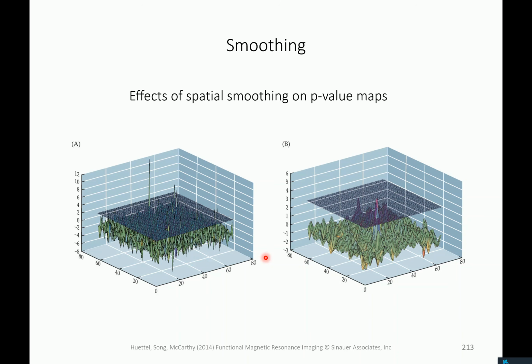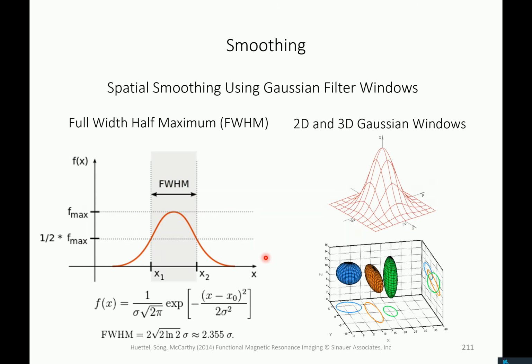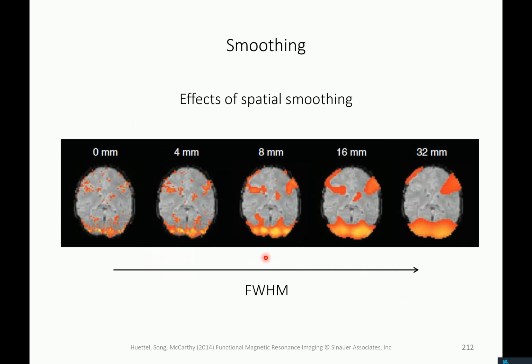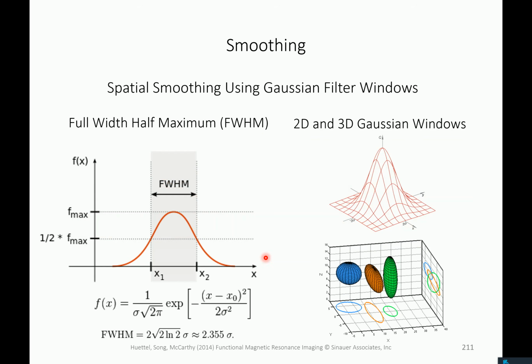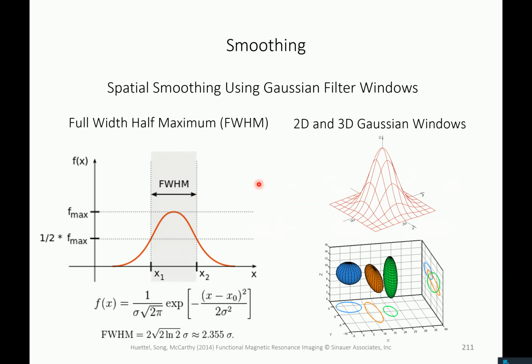That was a question. This filter, I don't really get it. Isn't this full width at half maximum always the same for a certain distribution? Because you're just aligning two. Maybe I didn't get it at all. But no, that's a free parameter of your filter. So you should not think about these things here as distributions. They are just functions.